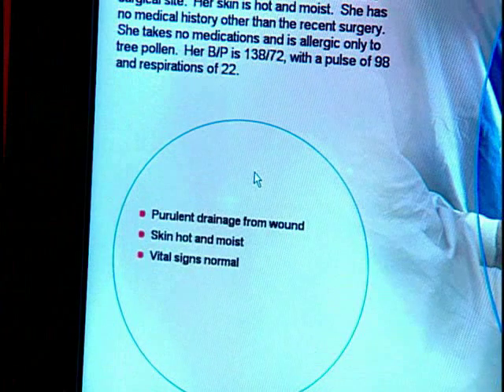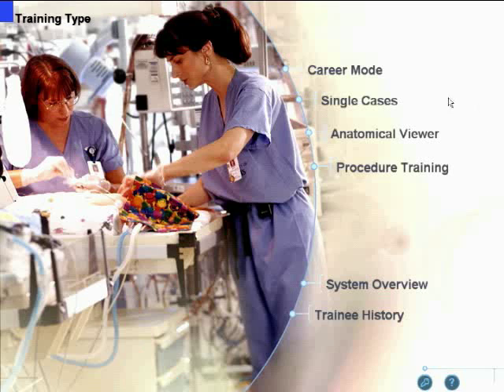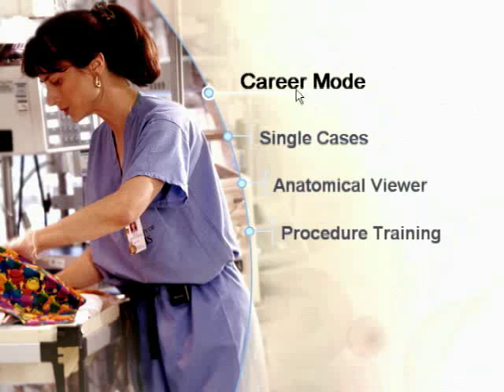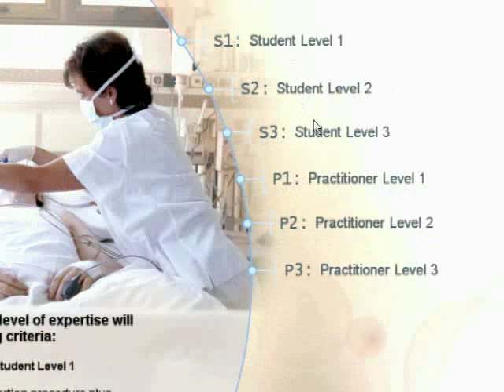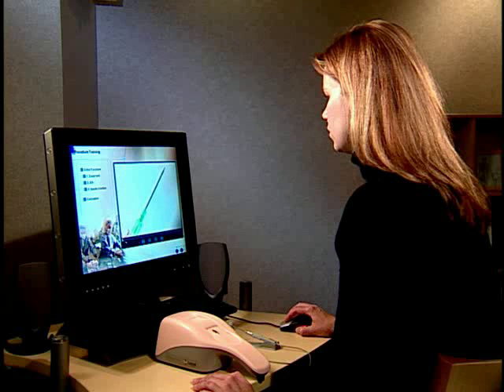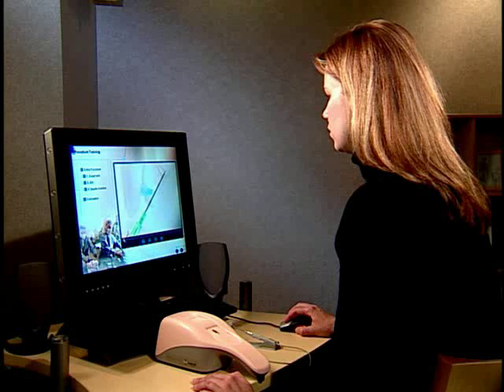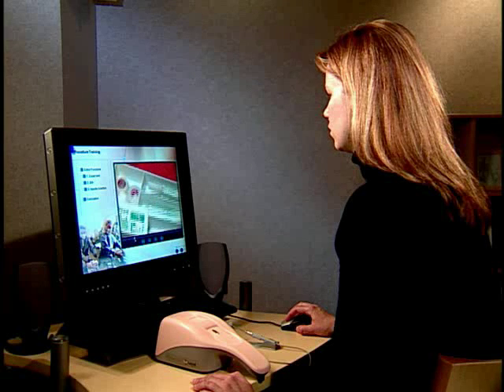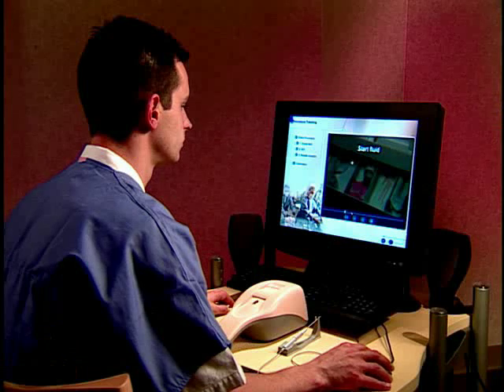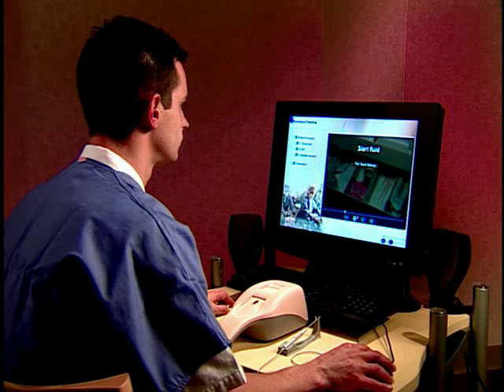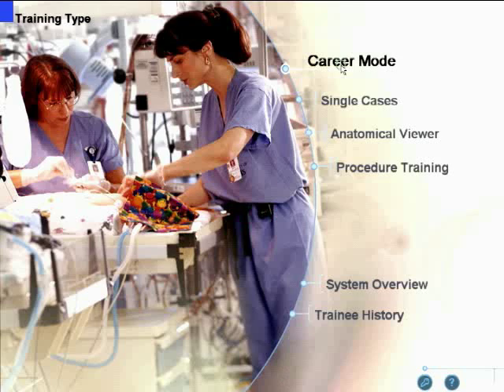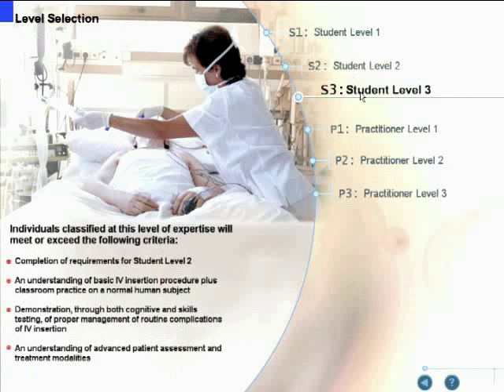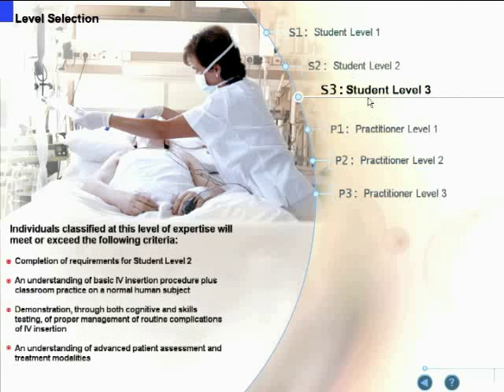To select a case, click on the case name and you will transition to that case scenario. Click on career mode for a comprehensive training curriculum that will advance your skill level and keep track of your progress. Career mode is an adaptive training system that provides level-sensitive training and remediation tailored to each user.